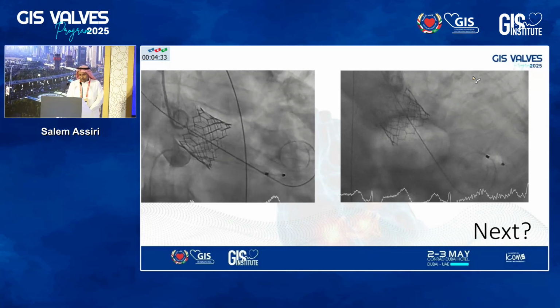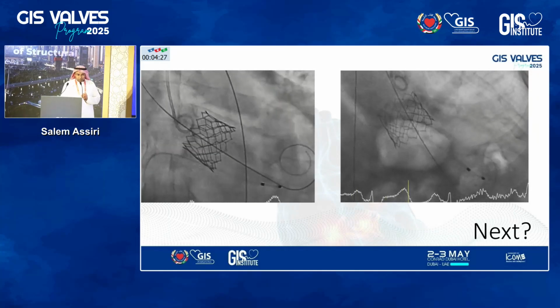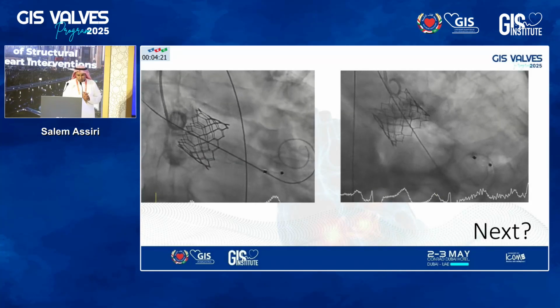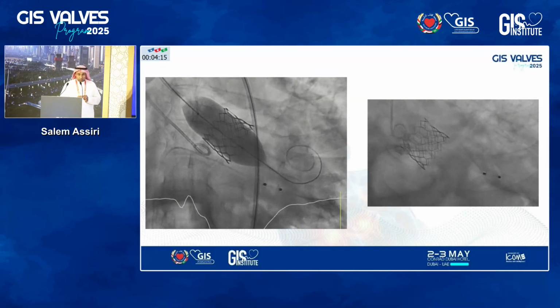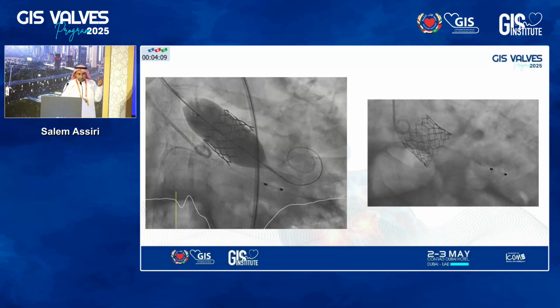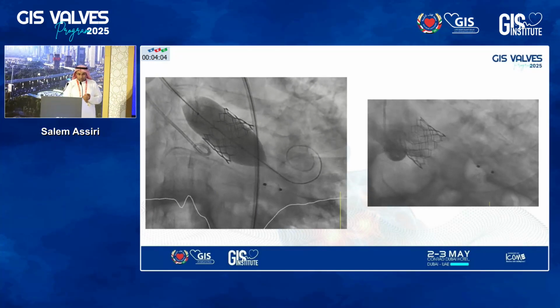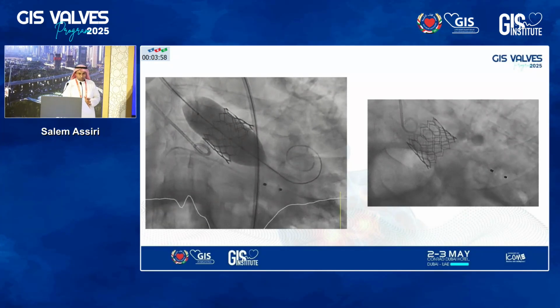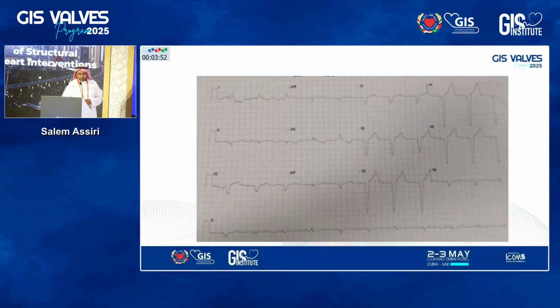So you can see here, conical shape, you can see that it's actually 70% in the LVOT, 30% in the aorta. And you can see the shape from the top is actually not that good, but not much of a PVL. So I decided to further balloon. So I post-dilated, and I did an extra step. I pulled the balloon back, and I tried to flare the proximal, the aortic part of it. And you can see this is the final on the right side. You can see the shape of the valve get better, but it's still pretty low, 70% in the LVOT, 30% in the aorta. Then this is the ECG.